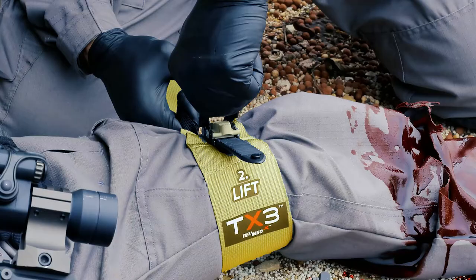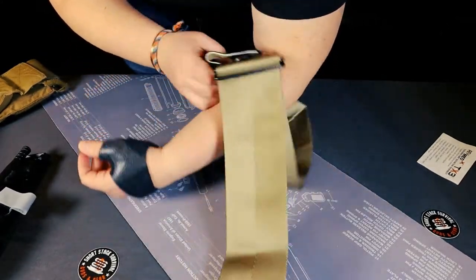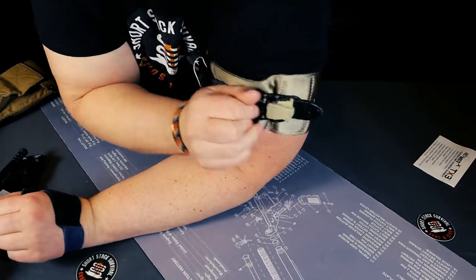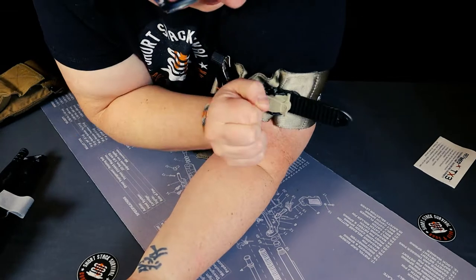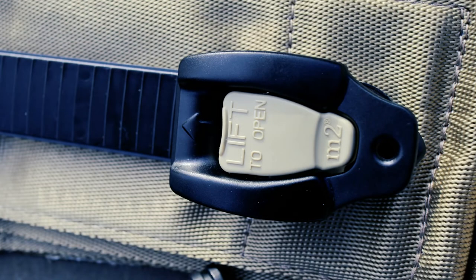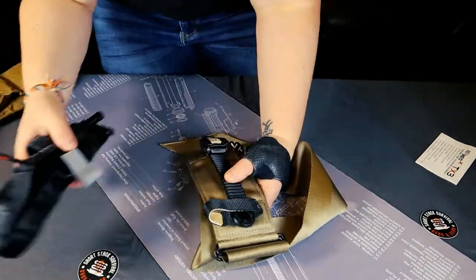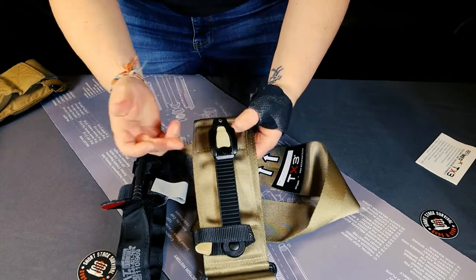Here's another tourniquet — the TX-3. What I really like about it is it's a ratcheting tourniquet, and it's made out of this seat belt material. If you needed to put it on your arm, you'd go high on the arm, just like we did with the CAT tourniquet. Get it tightened down, and then you start ratcheting down. It's going to be very uncomfortable. I still have some blood flow — a very faint heartbeat — but most of my blood flow is stopped. Then you lift and push away to get that off. I really like this one. I like that it's wider than the traditional CAT tourniquet, and most people know how a ratcheting system works. It also has a time stamp.